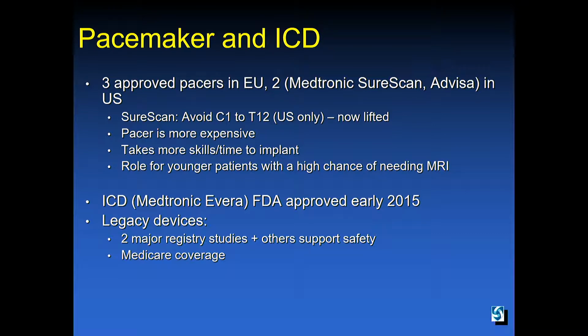But it is also increasingly common that centers are performing MRIs on the legacy devices, because several large registry studies show that as long as you are careful and follow very strict criteria with monitoring, performing the MRI on these devices won't damage the device and also does not cause patient harm.